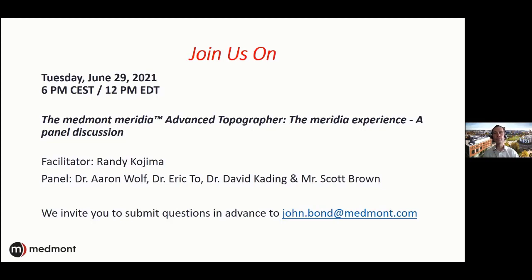So another question that came in, do you consider the TFSQ analysis standard of care for the tear breakup time today? So that's a difficult one, because there have not been too many direct measures about the different ways that companies have approached this. And likewise, it's going to depend a little bit on the instrument and the projection that it forms. So obviously with the Meridia, you've got many more rings there than many instruments, so you can take more fine measurement. And so they've developed an algorithm that works well with their particular imaging. To me, is it a gold standard? Well, it seems to work well, and it is an objective measure. So to me, that's what I'm looking for in terms of helping me as the clinician to know whether it falls into that category of unstable or apparently stable.